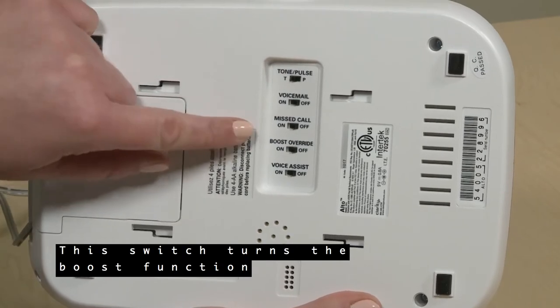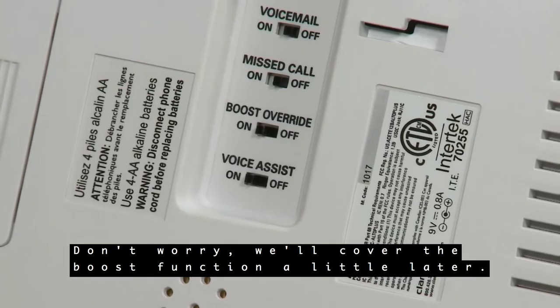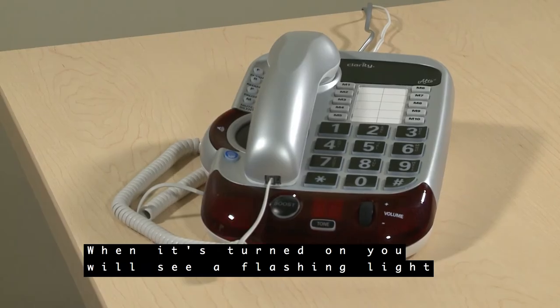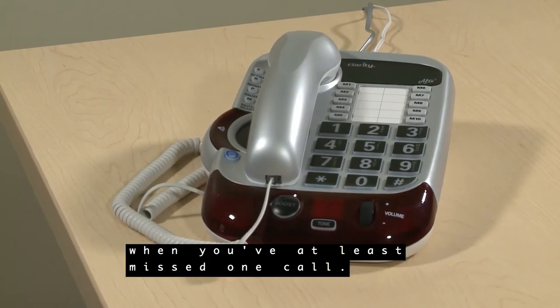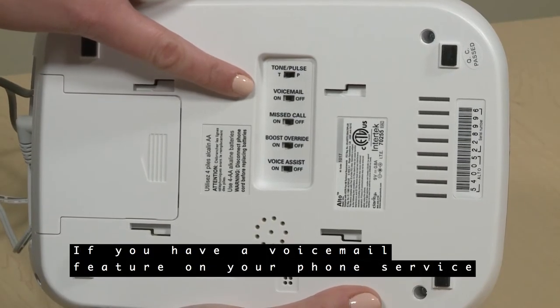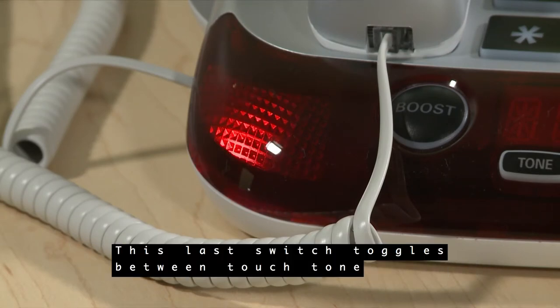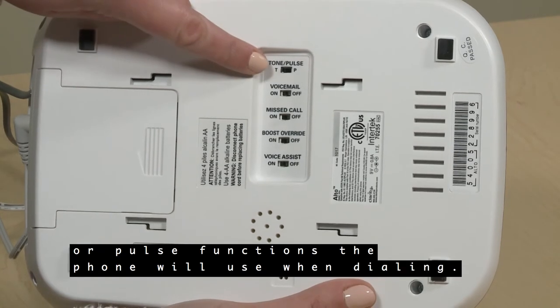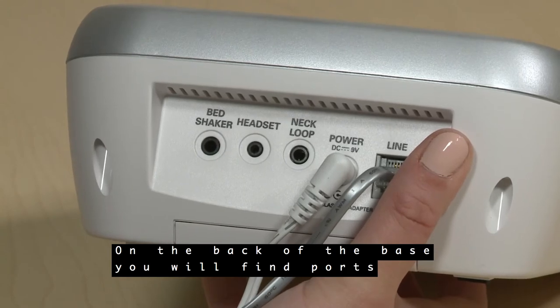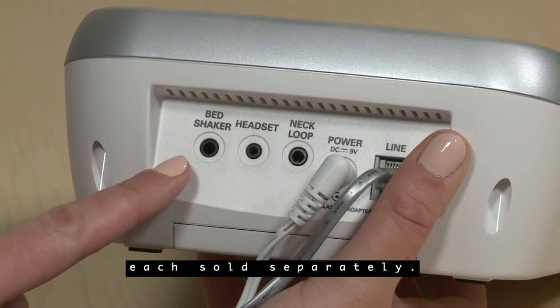This switch turns the boost function on and off — we'll cover the boost function a little later. The next switch turns on the missed call function. When it's turned on, you will see a flashing light when you've missed at least one call. Next is the voicemail function. If you have a voicemail feature on your phone service, this will let you know when you have a voicemail. This last switch toggles between touch tone or pulse functions the phone will use when dialing. On the back of the base, you will find ports to plug in a neck loop, a headset, or the bed shaker, each sold separately.